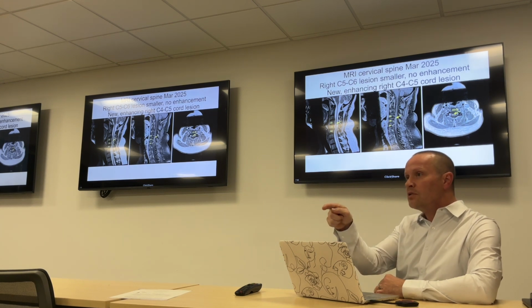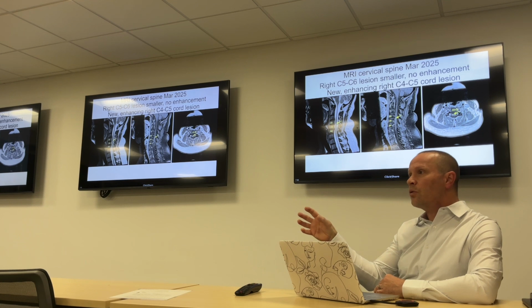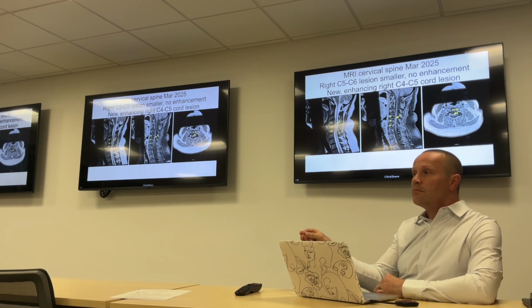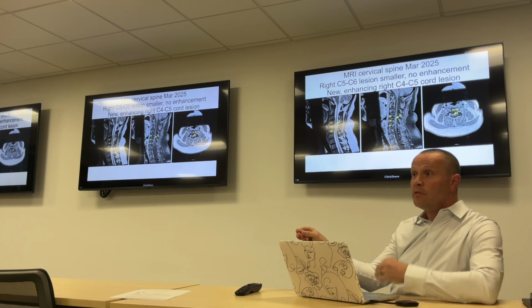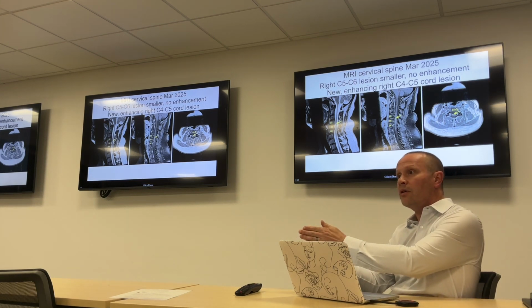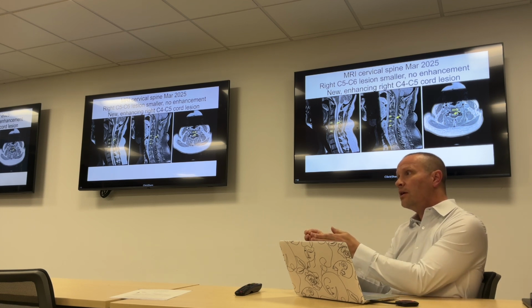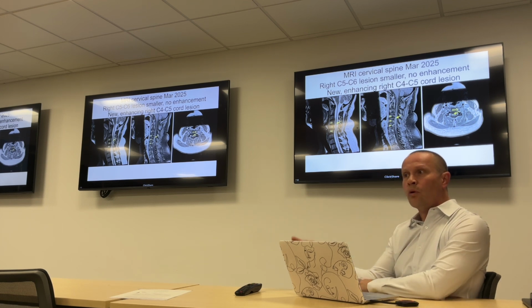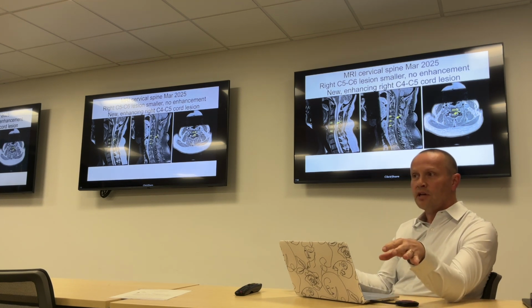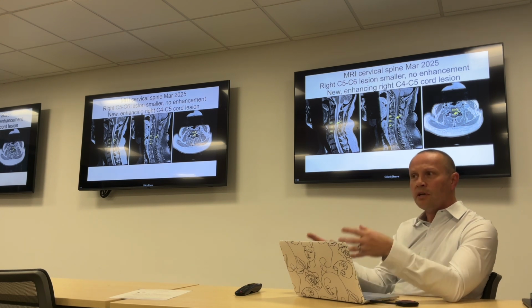And in the spinal cord next to it, there was some bright signal. You can get bright signal from edema, from a disc herniation that is mechanically pushing on the cord, for sure. But it looked to me like there was more signal in the spinal cord than I could attribute to that little disc herniation. It didn't match up exactly.